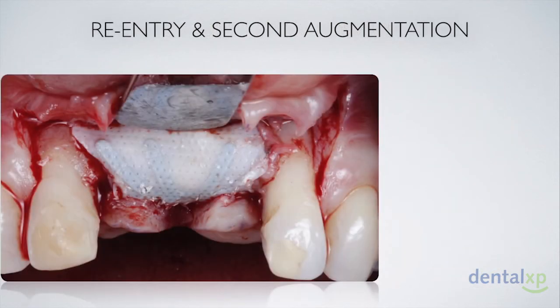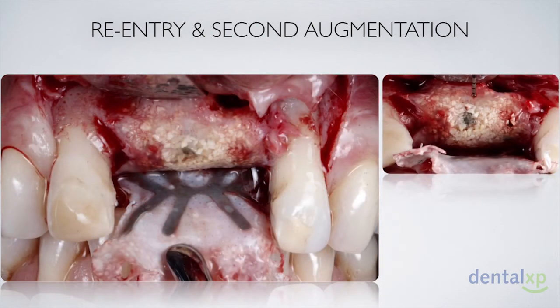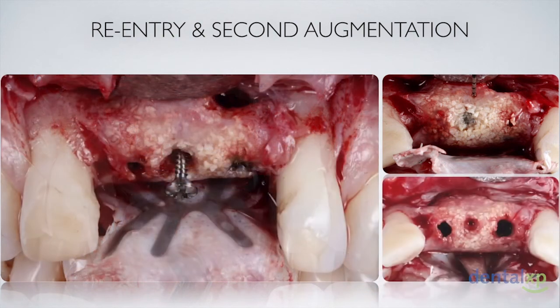So at 6 months, the site was re-entered and the membrane was removed to examine the quality of the augmented bone and integration of those implants. You could clearly see that some of the portions of the graft overlying the implant healing abutments and tenting screw were not fully consolidated and were removed, but the buccal aspect of the augmentation revealed good density of bone.